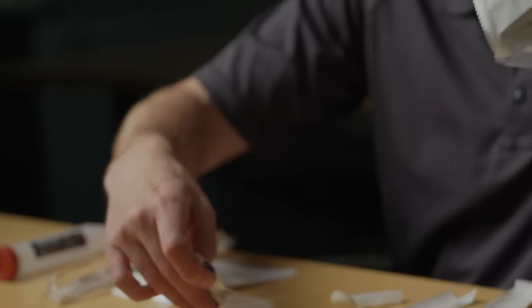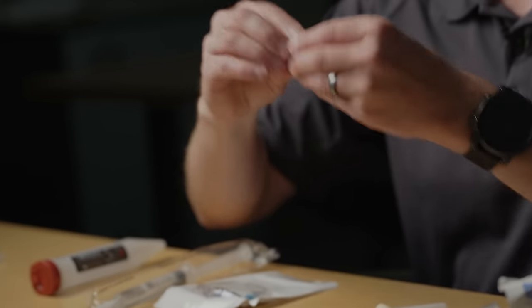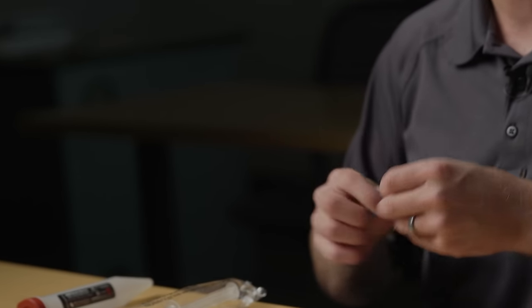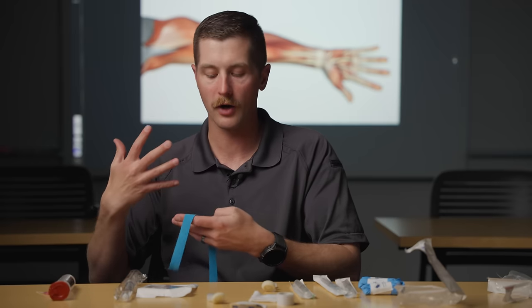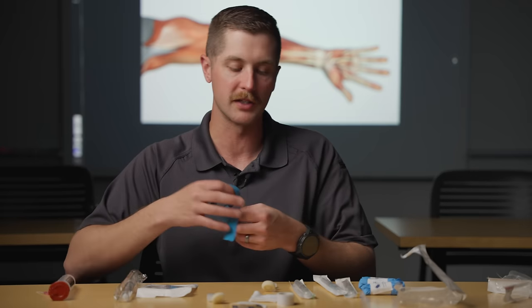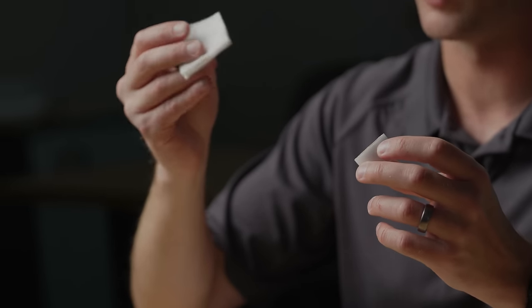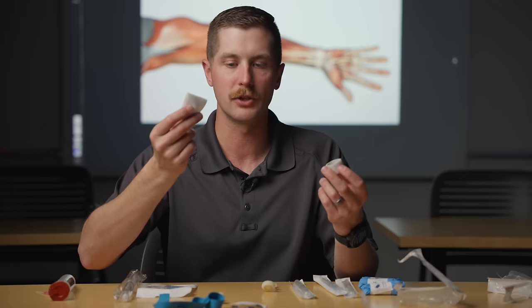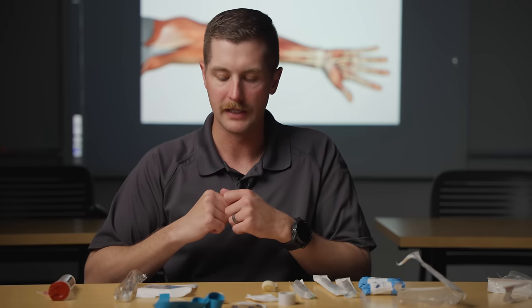The start kit has a chlorhexidine swab in it already. We've got our Tegaderm which keeps the site clean, and a tourniquet. This tourniquet stops venous return to the heart but it doesn't stop arterial flow to the arm, so it's going to pump up the veins and make it a little bit easier to stick. We've also got some tape and gauze that you can cover the site with, or if you miss, take the needle out and stop the blood flow.